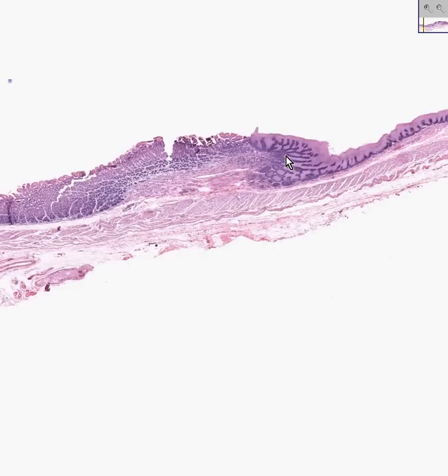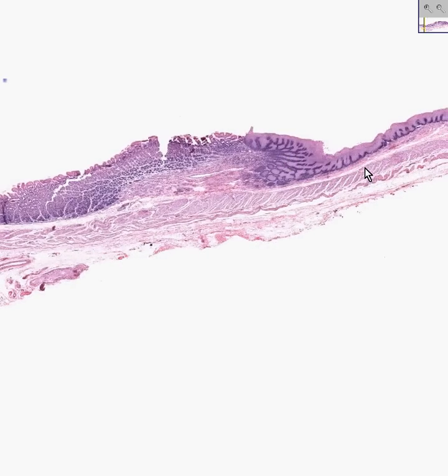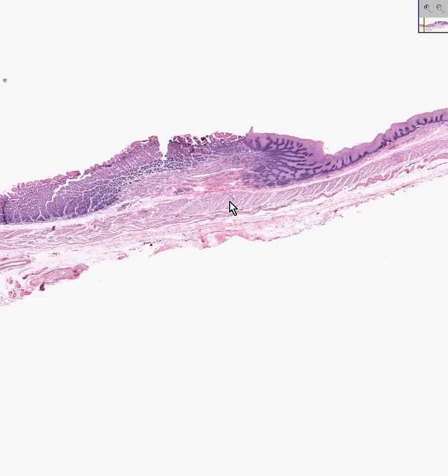Notice also that if you look at the smooth muscle underlying the esophagus, it gets a little bit thicker right here at this junction. This is the so-called sphincter of the cardioesophageal or gastroesophageal junction, although this so-called sphincter is more of a physiological sphincter. It's not as bold as you would see in the other end of the stomach, the so-called gastroduodenal sphincter.